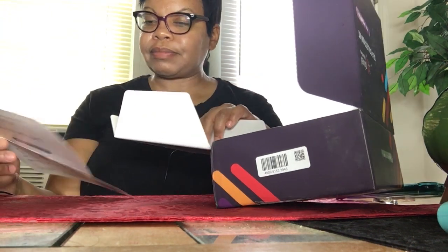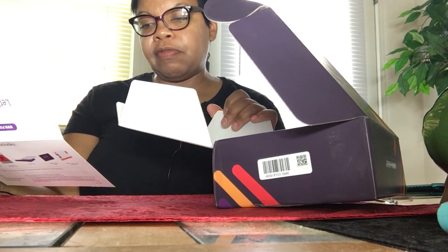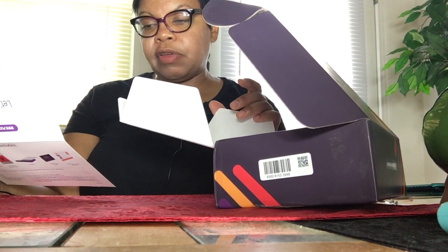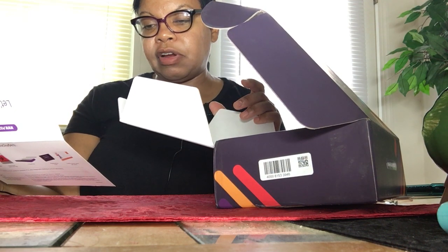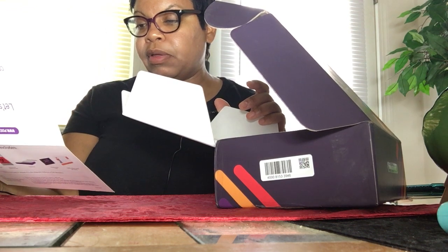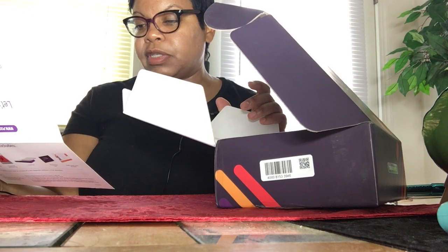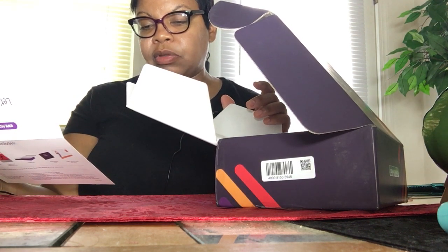Insert the tip of the foam swab into one nostril. The foam swab does not need to be inserted far — insert just until the foam tip of the swab is no longer visible. Rotate the swab in a circle along the entire inside edge of your nostril at least three times, then repeat with the other nostril. Remove the foam swab from your second nostril and place it in the collection tube — the end that went into your nose goes in first, so it sits down in the liquid. Screw the top of the collection tube back on well, and wash your hands again.